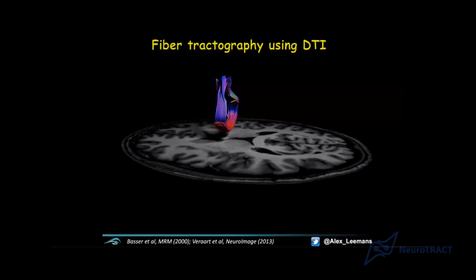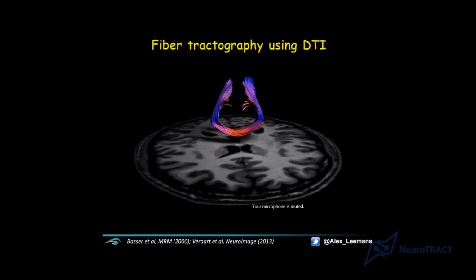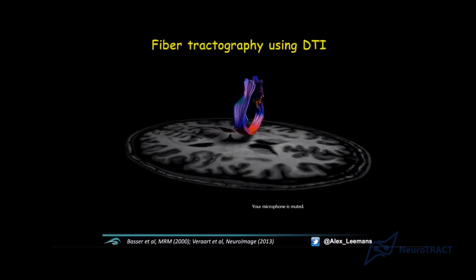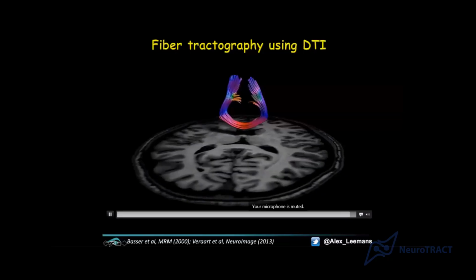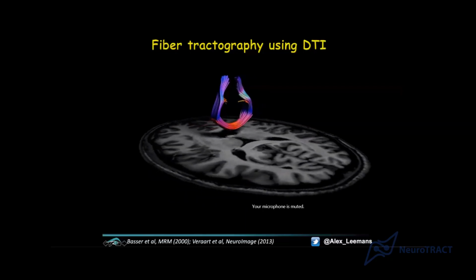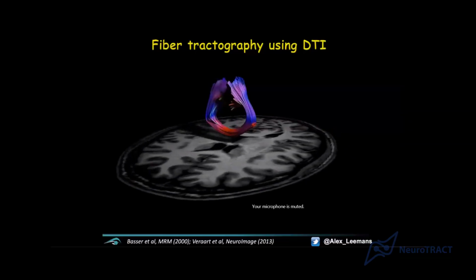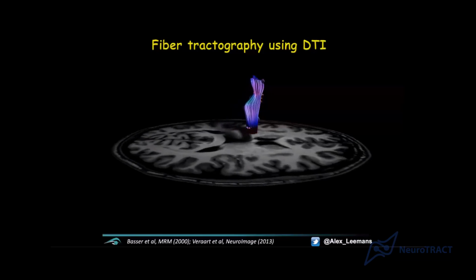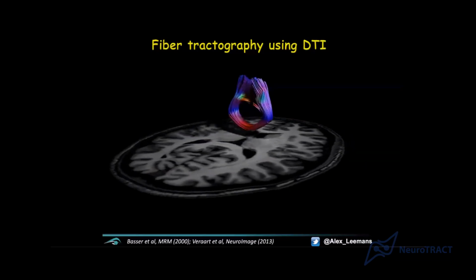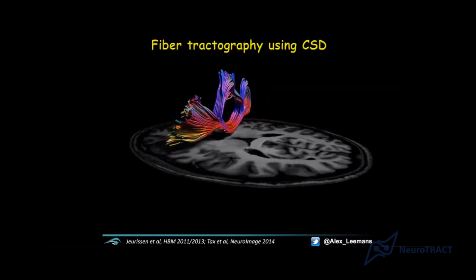Obviously, if you're doing tractography, same issue in a way, right? So this is the same data set, and we're looking at a mid-coronal section. I placed a few seed points here in the middle, and this is the result that we got with DTI-based tractography, meaning we would only look at the ellipsoid and at the dominant orientation and follow it wherever we can. But if we use CSD-based tractography, then this is what we got, right?